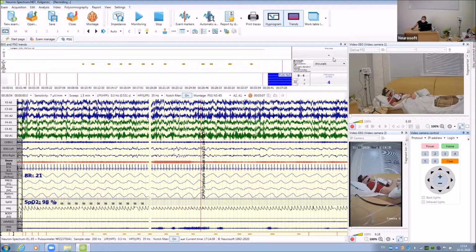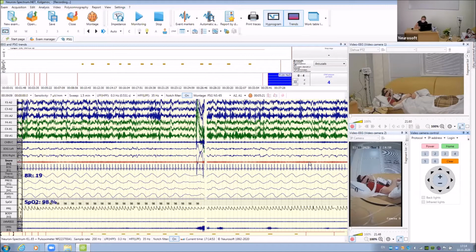So now we ask our patient to make breathing pauses. Okay, and Anton, please. What will I do? Please stop breathing. Hold the breath.